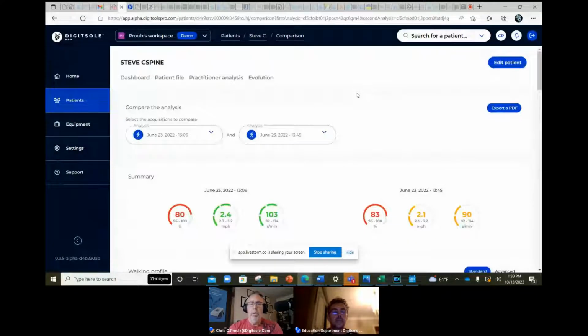So with your system, you can actually click on those three dots, and it allows you to do a comparison. Like I said, I don't normally do this during the day of a treatment because the acute responses sometimes don't necessarily happen. It's like testing someone's strength, having them do one session of exercise and then expecting it to change.